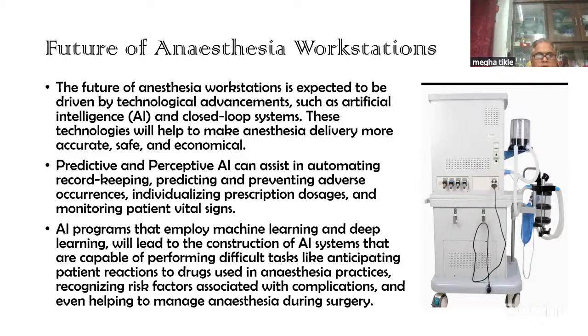Now, AI programs from machine learning and deep learning will lead to systems that are capable of performing other difficult tasks like anticipating the patient's reaction to drugs used in anesthesia practice, recognizing the risk factors associated with complications, and even helping and prompting us to manage anesthesia better.